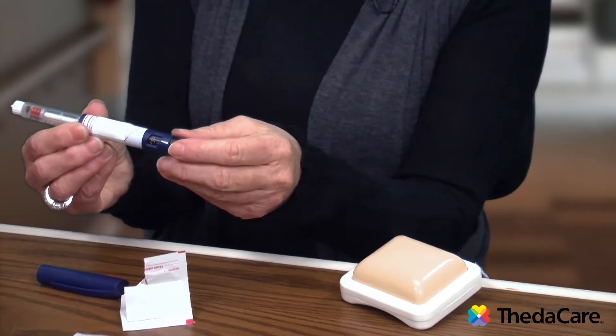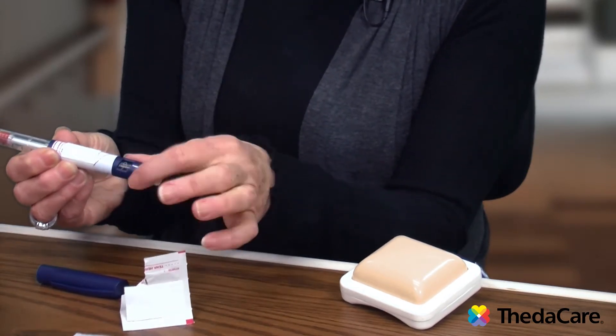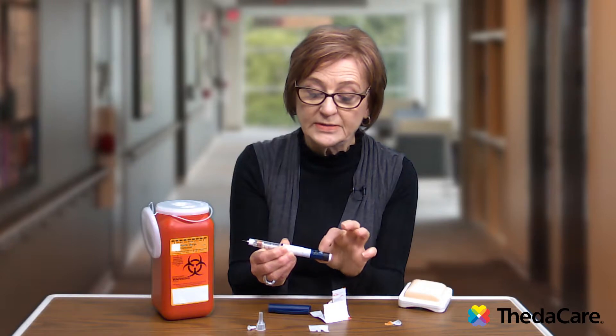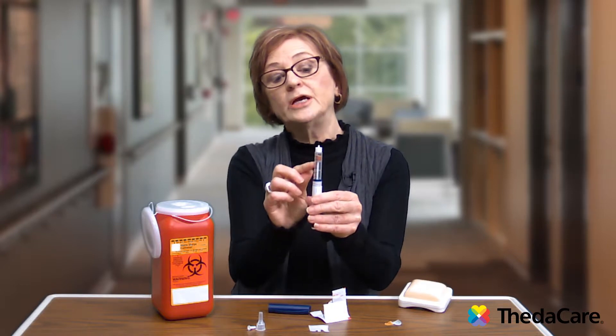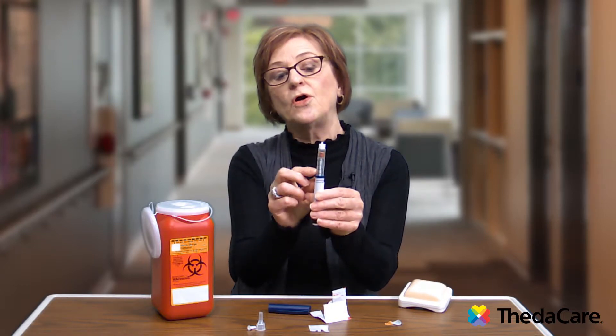To do that safety test or air shot, you have a dose indicator on one end of your pen. Dial that up to two, lining it up with the marker on the pen. Then, holding it straight up, check your cartridge to see if there are any air bubbles caught in there.